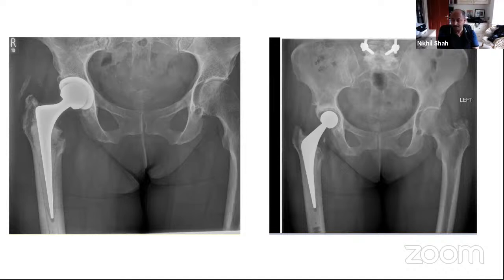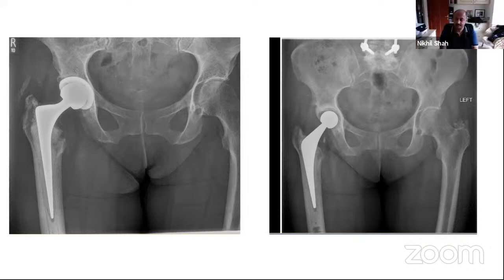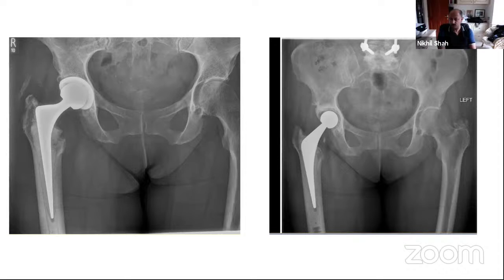My only question is, with that kind of residual bone, where you have already curetted out the previous cement, hardly any cancellous bone left, and you have not done an impaction bone grafting here. So in this case, I haven't. Do you think this mantle will behave as the primary mantle? Biomechanically, it shouldn't, but she is reaching. That X-ray was taken at 4 years, which was last year. She did not come for the follow-up this year in the COVID crisis. So she will reach 5 years. And there was enough good bone for me to feel comfortable cementing.